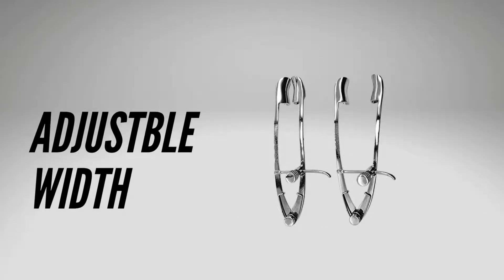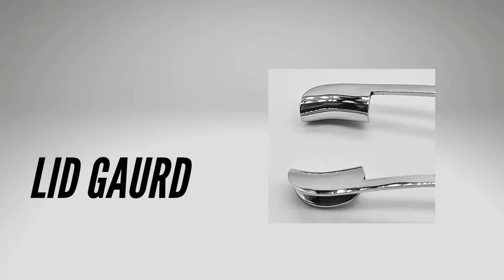The Lancaster eye speculum is a rigid speculum which allows for adjusting the width of the palpebral fissure. In addition, it has guards to keep the eyelashes away during surgery along with the use of surgical drapes.